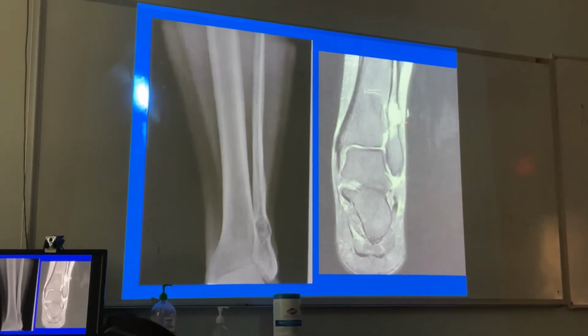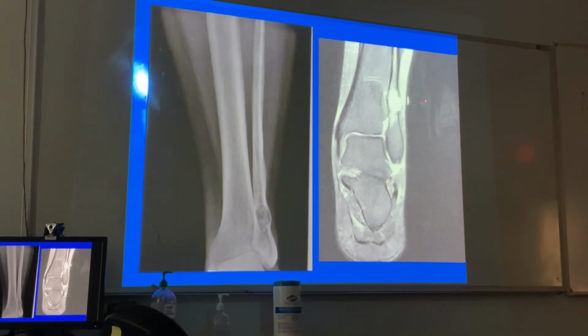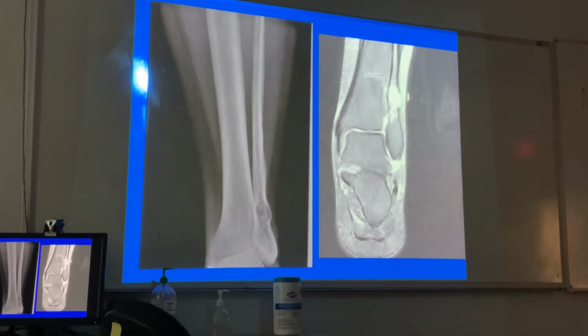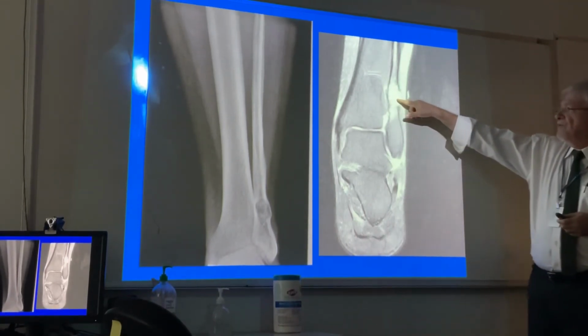Is there expansion of the bone here? Of the cortex, yes. Is there expansion on your plain film? Yes. This is a little marker that they use. This is exactly where the area of interest is on the MRI. Okay? What happens to this fibula if it keeps getting bigger and bigger and bigger? Fracture. This just pops.